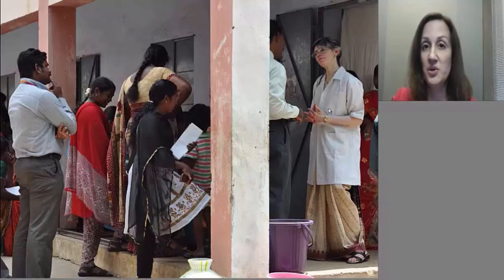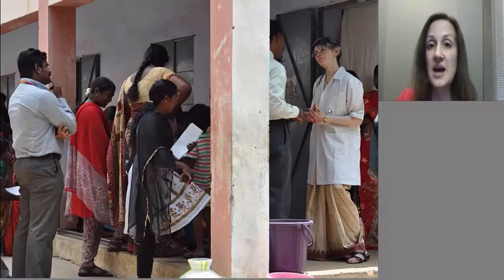Raj and Geeta both are in dire need of a way to give patients the results of their HPV screen at the point of care. Many women do not know what their status is of this disease, and many women cannot be treated directly at the point of care unless they do know their status. So one of the projects that the center is working on, along with Dr. Dewar, is on a rapid point of care diagnostic for HPV that could be used at the point of care.